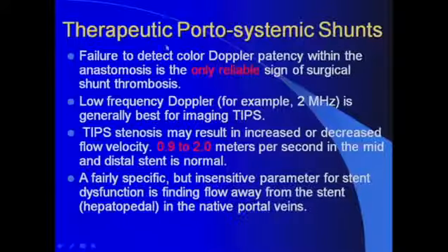All right, so now we are going to talk about therapeutic portosystemic shunts in these patients with cirrhotic changes. We evaluate those portosystemic shunts every now and then to make sure that they are patent and functioning. The most important thing to keep in mind is to try to avoid evaluating these shunts immediately after being put in.